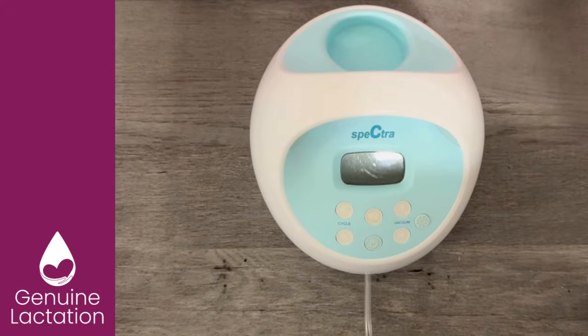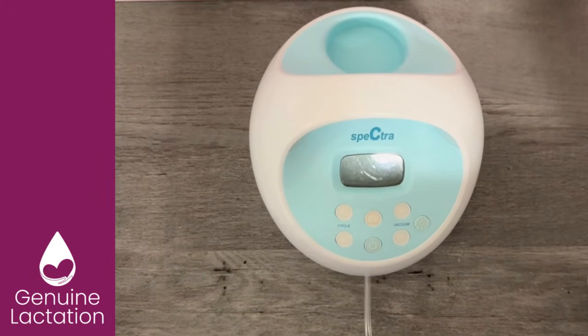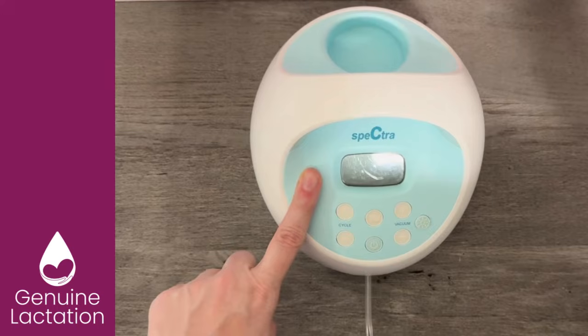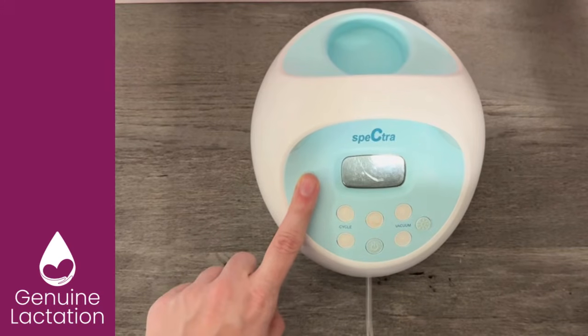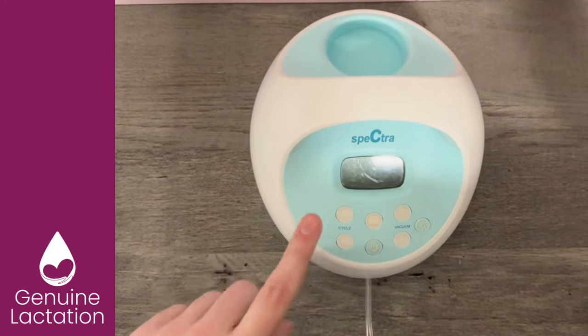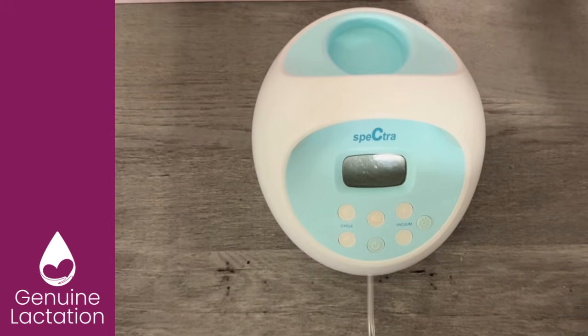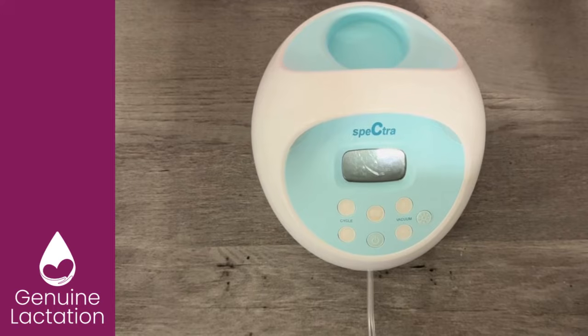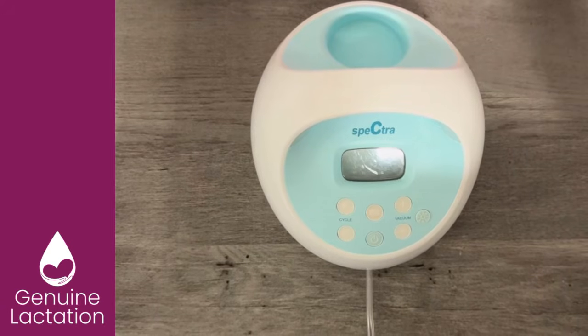Okay, so let's learn how to use your Spectra S1 or S2. The Spectra S1 and S2 are exactly the same machine. Think about it this way. The blue is the Spectra S1, blue is for battery. That means this has an internal rechargeable battery, so I do not have to have this plugged in. The pink means plug-in. That means in order to use it, I have to have it plugged into a power source, so either an external battery or plugged into the wall.